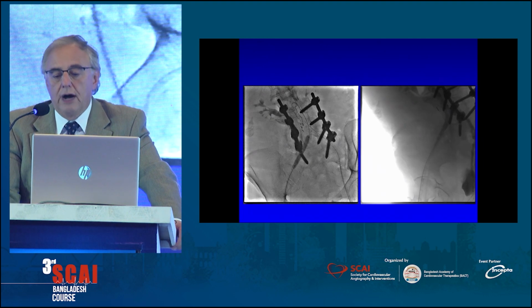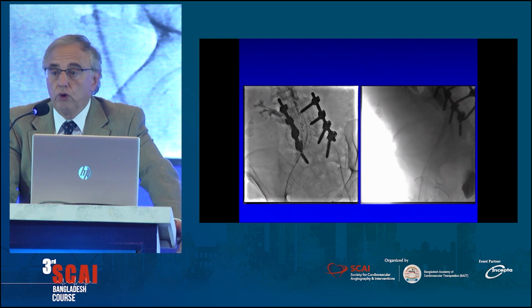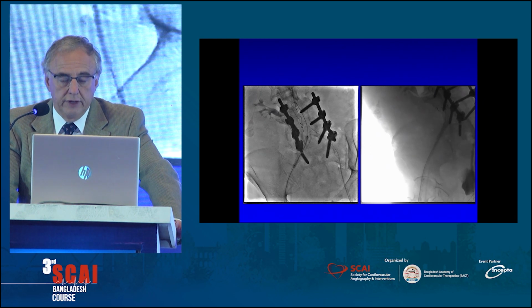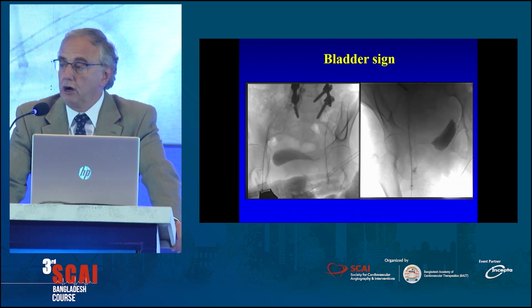All right. So after that, the hematoma, the perforation completely resolved. You have to have the ability to do this. Otherwise, I will not do iliac intervention. It's much more common in the external iliac than in the common iliac. This is something that you will not see that often, but it's very interesting.